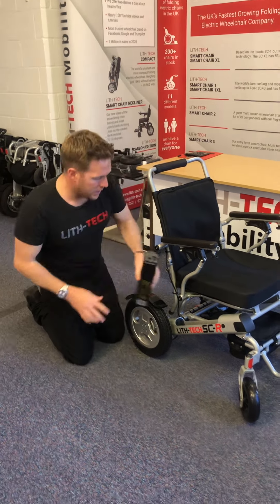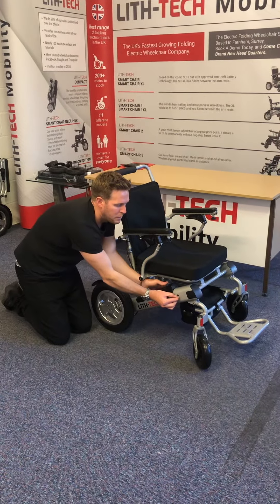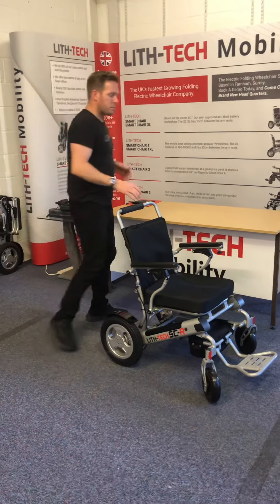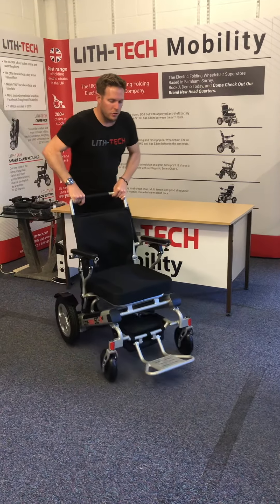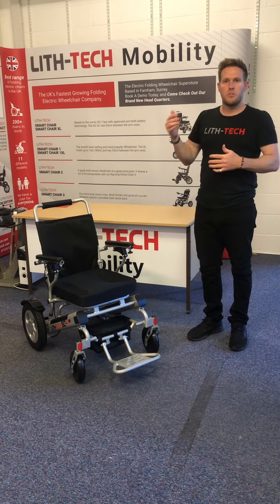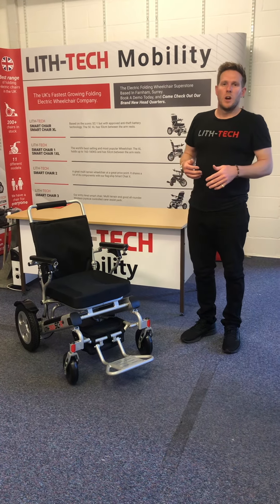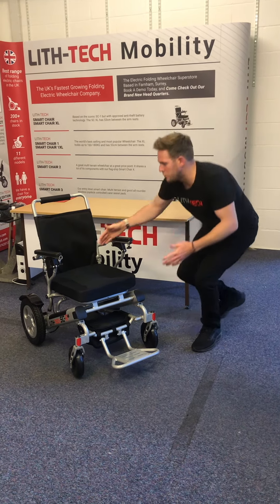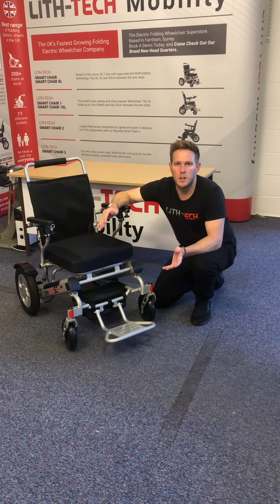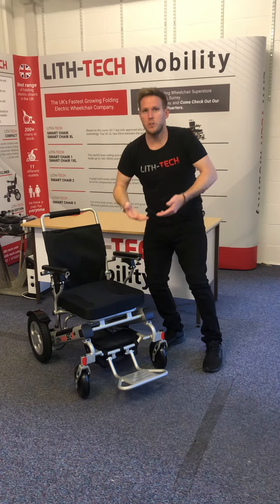When inserting your battery back into the chair, make sure you're nicely lined up. You need to turn the little tab anti-clockwise, press in, and that will make the battery go into the slot nicely. We've also got a slightly lower foot plate on this model. One of the issues with the old recliner was it had two foot plates — one for children and small people and one for adults. The problem was you couldn't really go past 6 foot because the foot plate was slightly too high. On this model you've got a slightly further back seating position with a lower foot plate, which means it will now cater comfortably for anyone between 5 foot and 6 foot 2 — and even a bit taller, though you would need a slightly higher cushion to stretch your legs out.